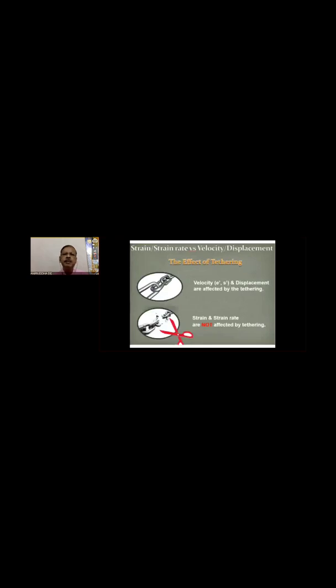But one thing must be clear in the mind. There is always tethering, but tethering is not the strain. Strain and strain rate are not affected by tethering, whereas the velocity we measure in the TDI, the E prime or the S prime, or the displacement, is affected by tethering. So it's a better choice.